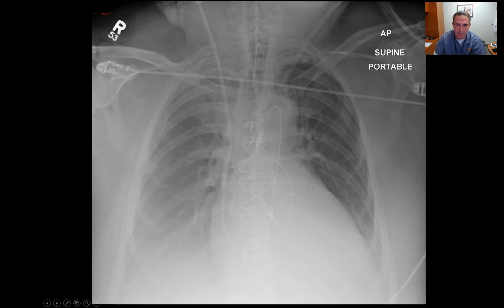This was a catheter that comes up through the leg and has this little hook thing on the end here. It's called the Impella catheter. Basically, you can think of it as a left ventricular assist device that you insert intravascularly. So an intravascular left ventricular assist device. It sucks blood out of the left ventricle here and pumps it out above the aortic valve here.